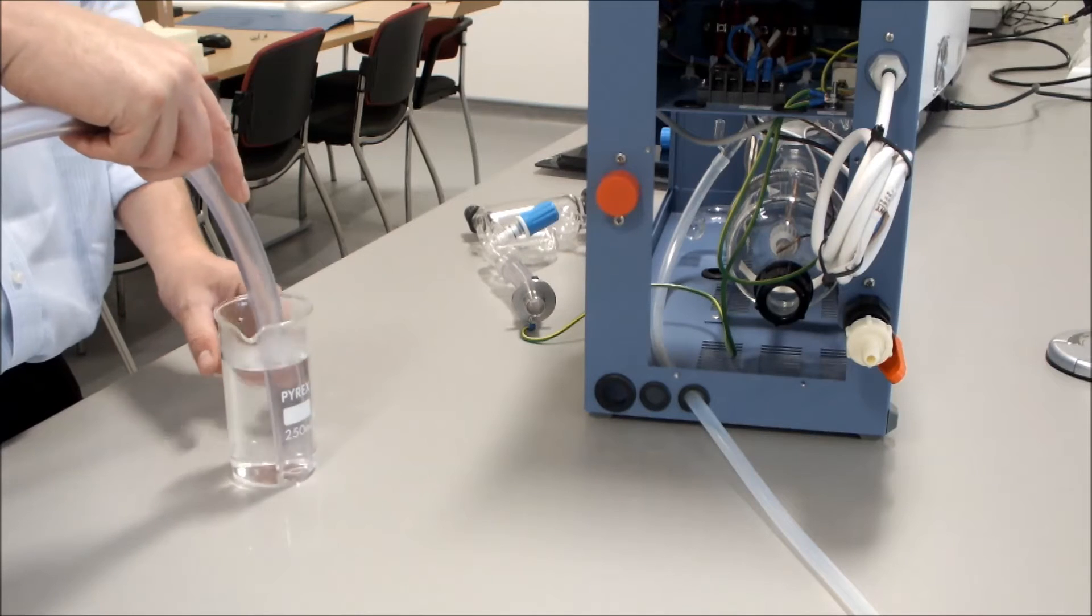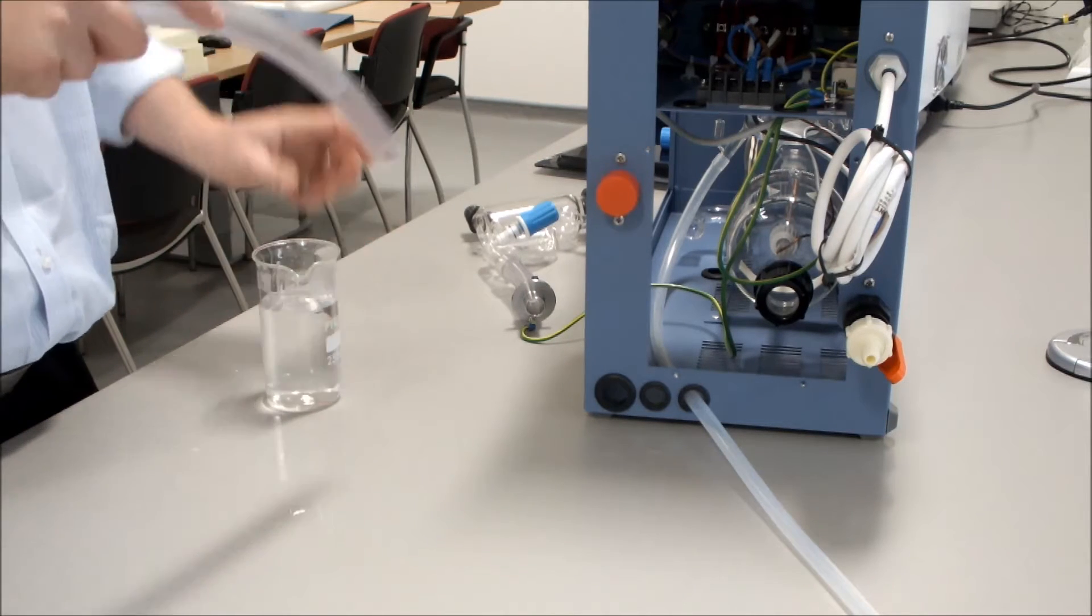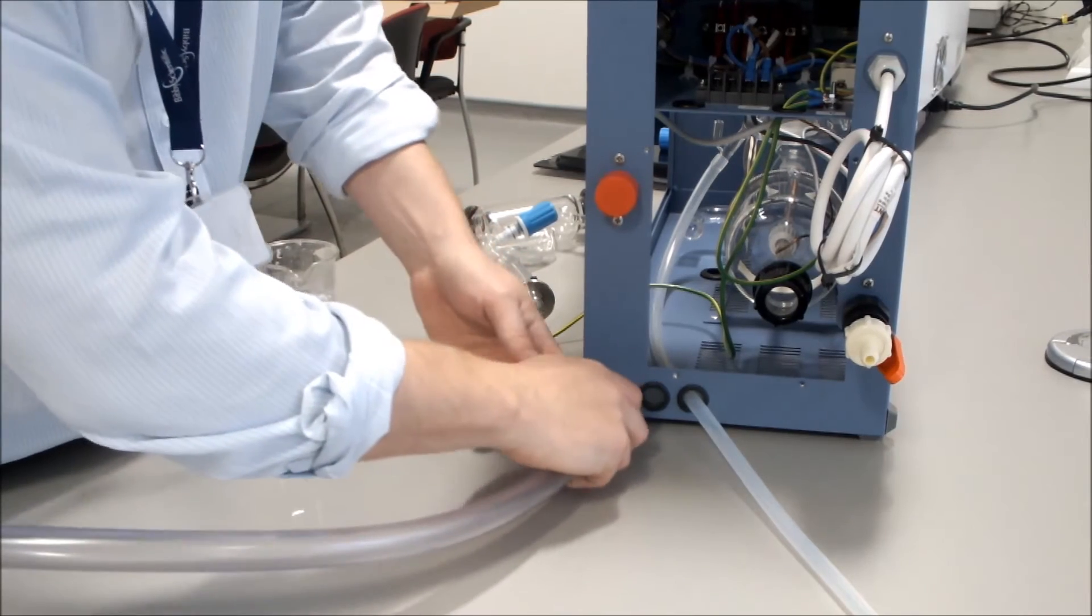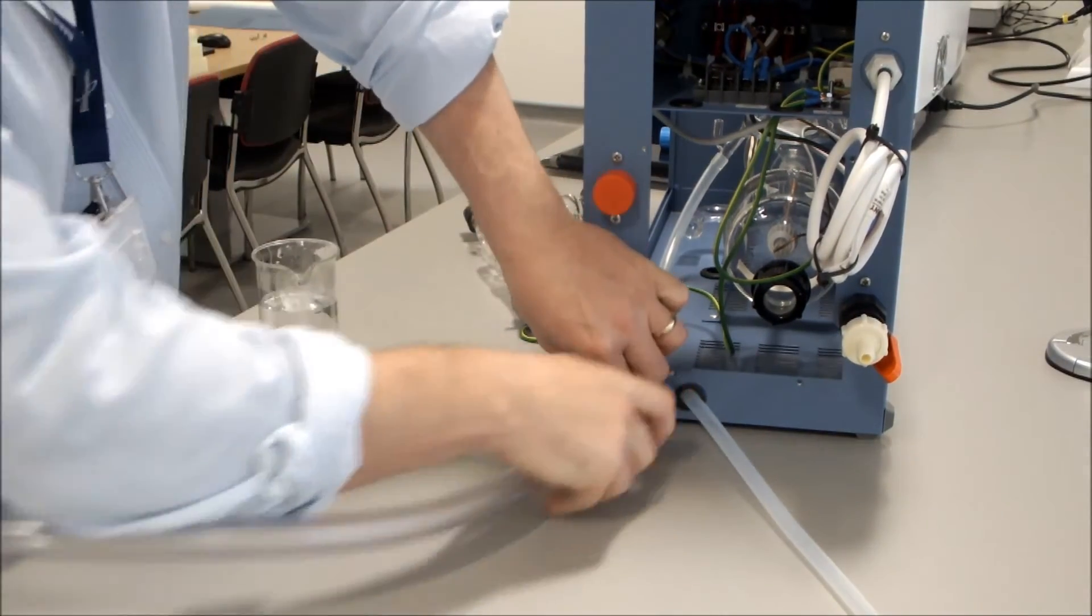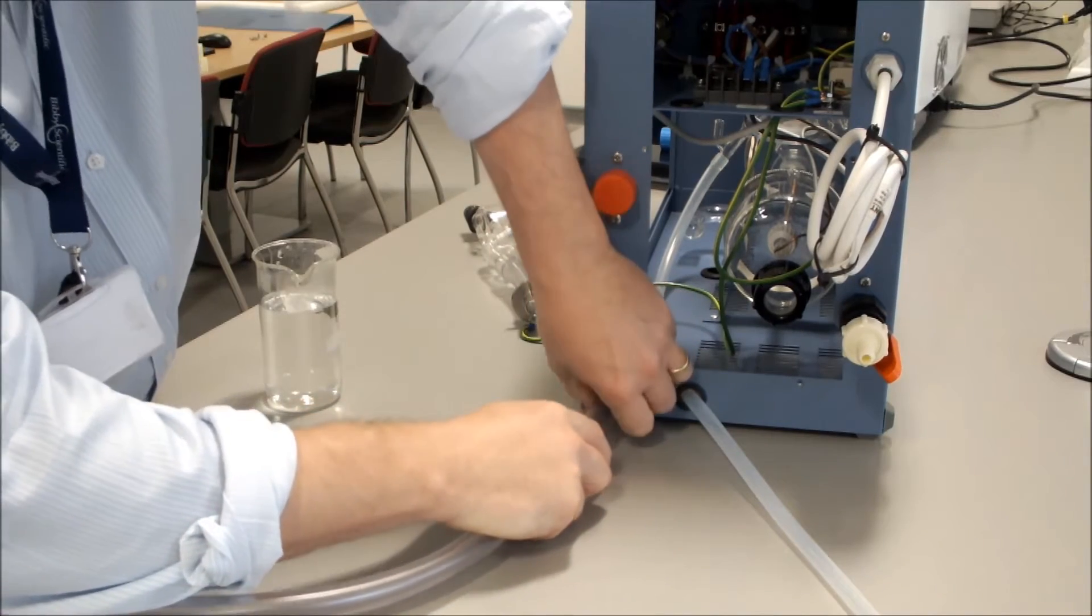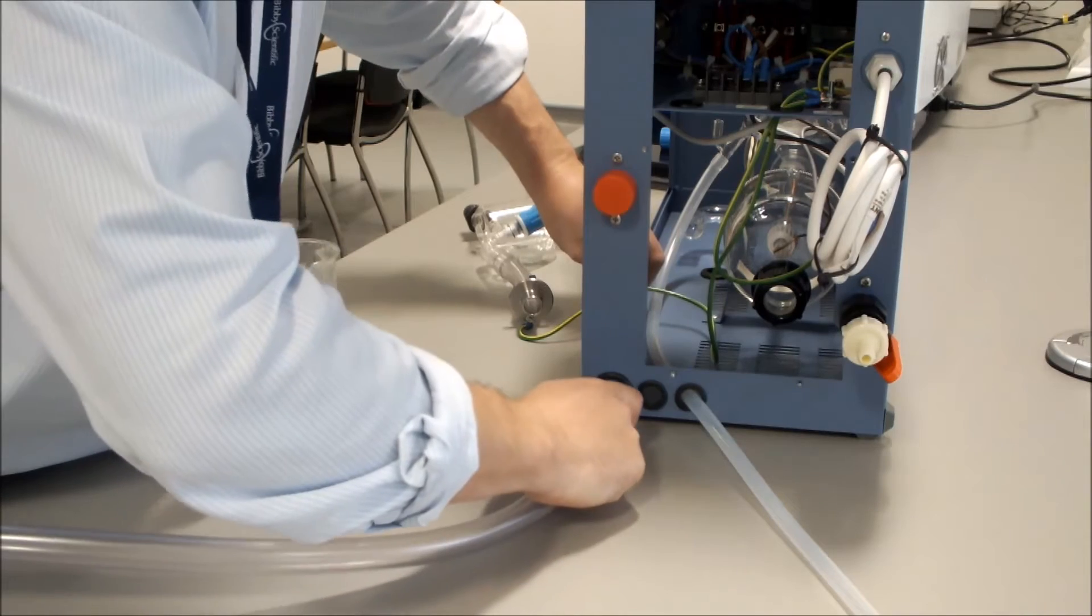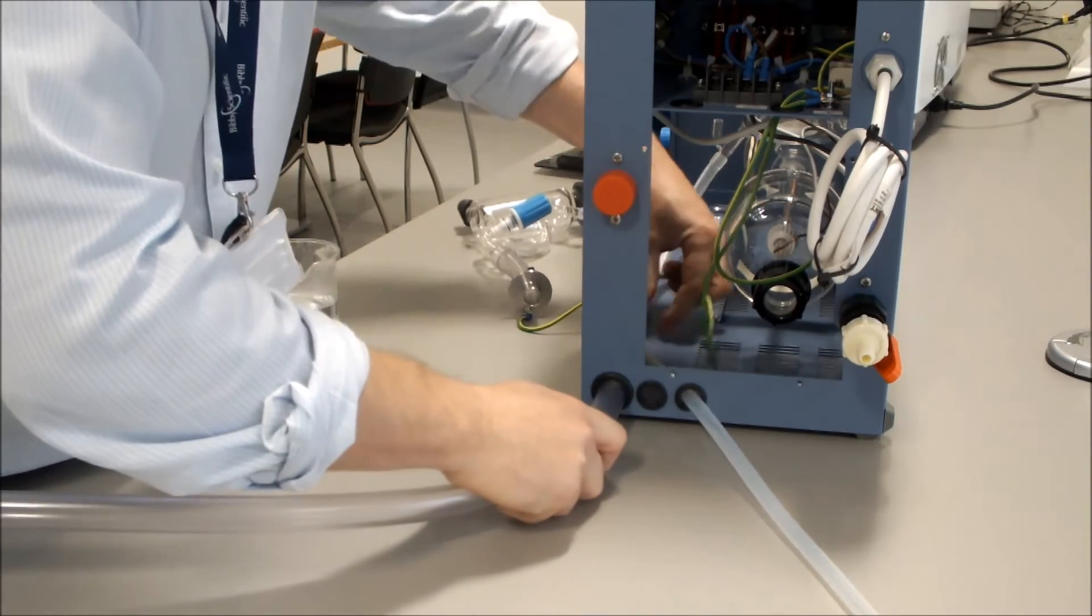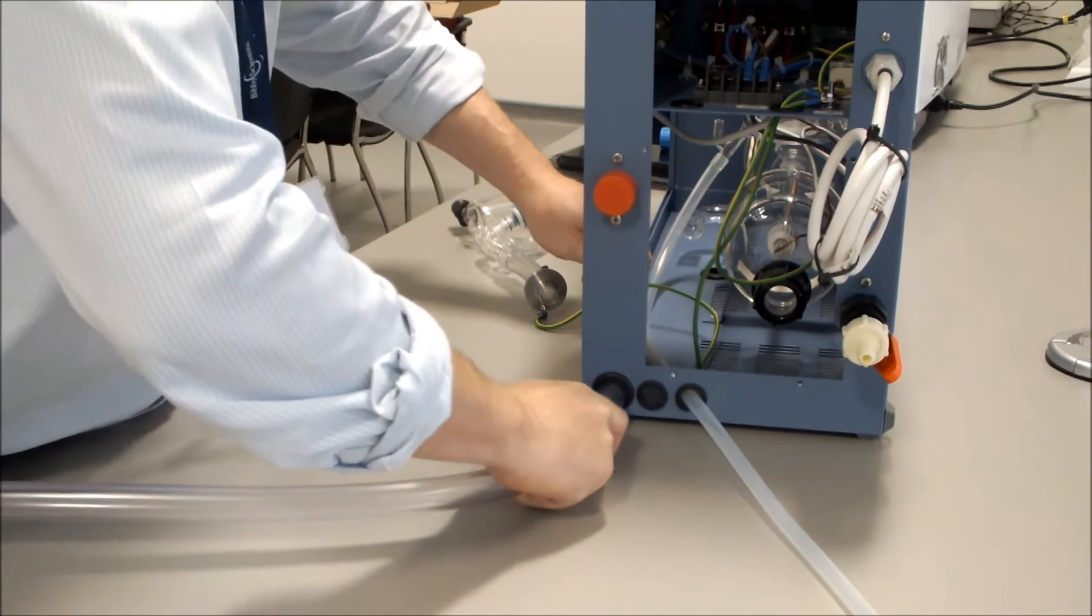Once the 16mm tubing has been in the water for approximately 20 seconds, it can be taken out and fed through the largest of the three holes inside of the unit. Once it's through, it needs to extend into the unit by approximately one foot.